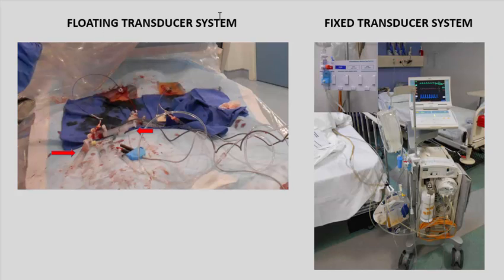And this is an example of a floating system where the catheter that's inserted into the patient through that sheath is connected in a direct line to the transducer, and the transducer, through its little manifold system and a plunger, can inject or draw blood or saline via a port through these clear lines that are hooked up to a saline bag up the top.